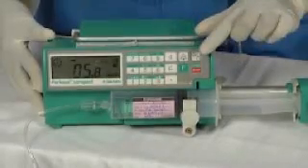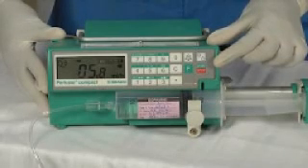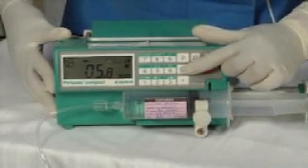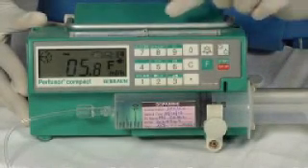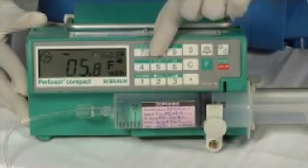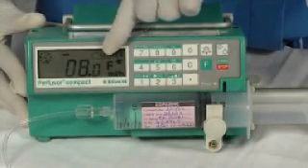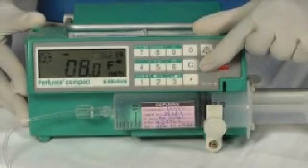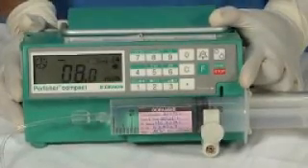Changing the flow rate. To change the flow rate while the infusion is on is simple. First press the cancel button. The F display will come on. Then enter the new rate using the keypad — here we enter 8.0. Then press the F button to accept this new rate. Finally, press the start button to start the infusion with the new rate.